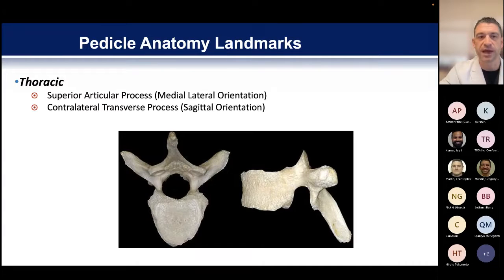Just a few things on anatomy, especially as it relates to placing pedicle screws in the open setting. The pedicle anatomy differs a little bit in the thoracic versus lumbar spine, and a few different things to make note of in the open setting is that you always want to make sure that you have your exposure adequate in order for you to be able to adequately place your screws safely.